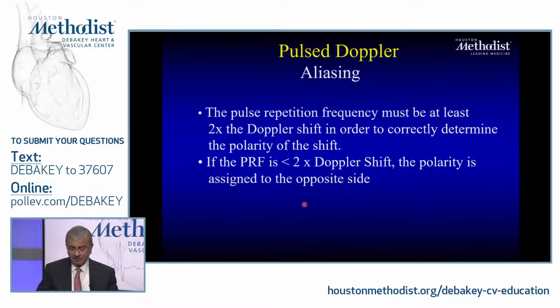Same thing. I don't know how many people are going to disco nowadays with the pandemic, but if you have a strobe light and you're seeing people dancing, at times it's an illusion that you're seeing them moving in the wrong direction, because the frequency of your imaging is much less than what you need to be able to see the correct way of movement.